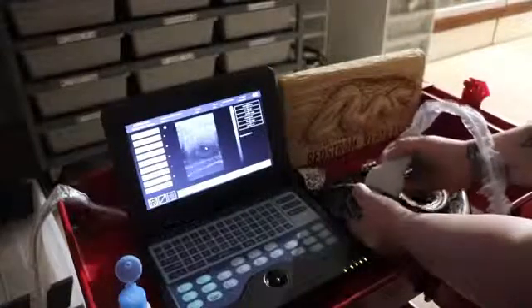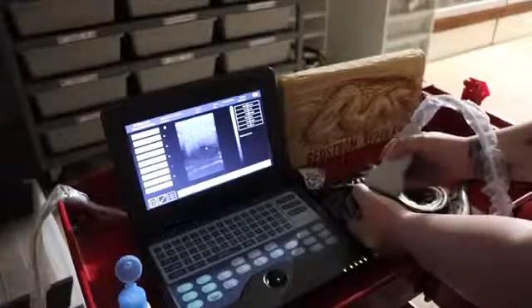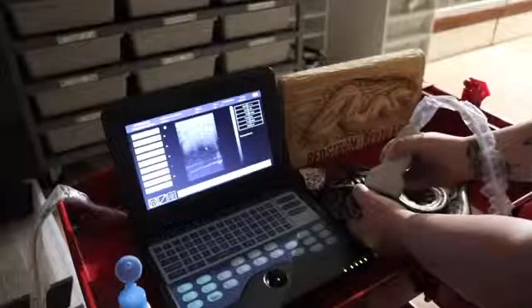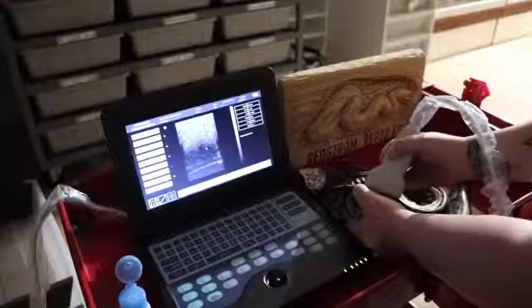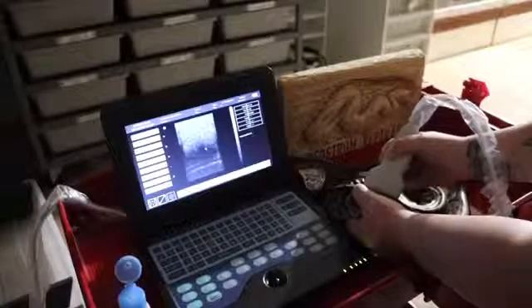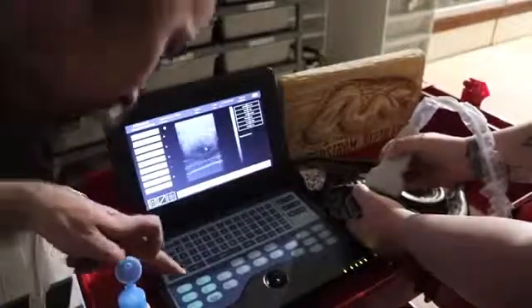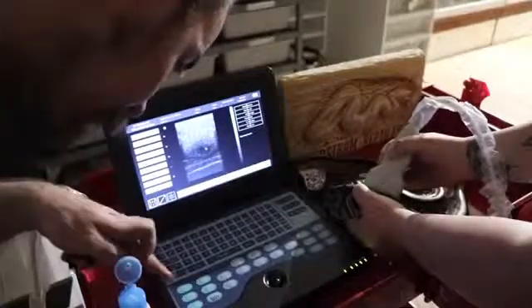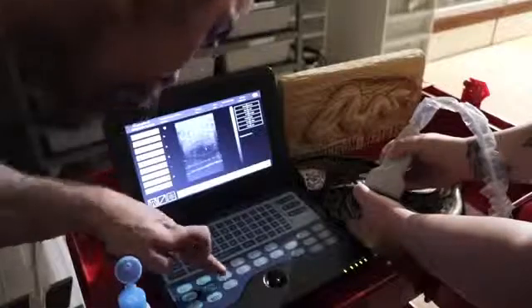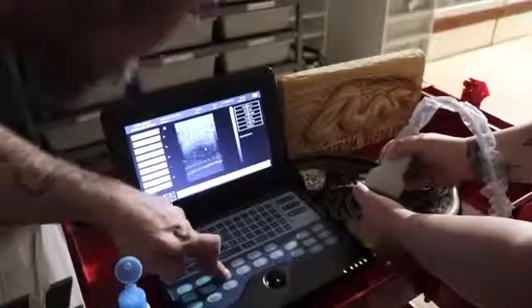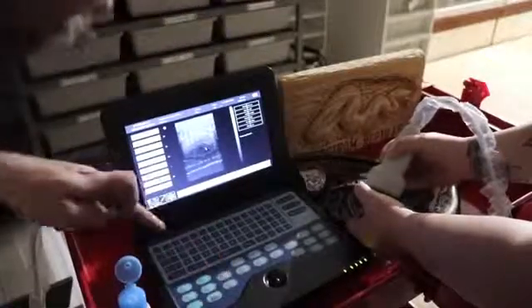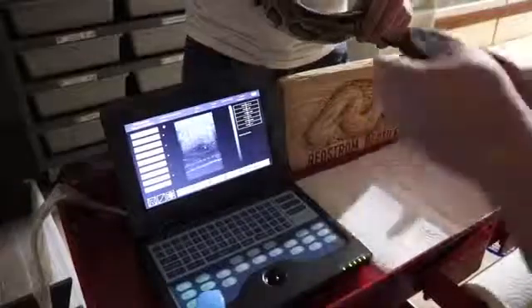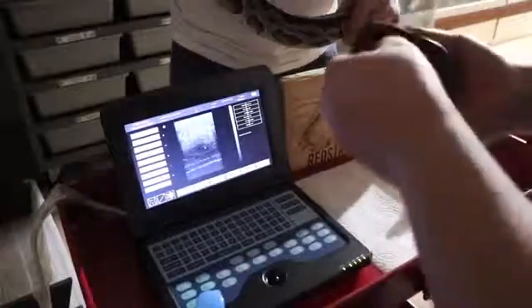So she should ovulate pretty much any second now. Can you hit the freeze for me? It's like a snowflake. Alright, so now we froze that picture. What I like about this ultrasound that the other one we had doesn't do is you can actually plug a mouse, like a computer mouse into it. Oh, you know what? The mouse isn't turned on.